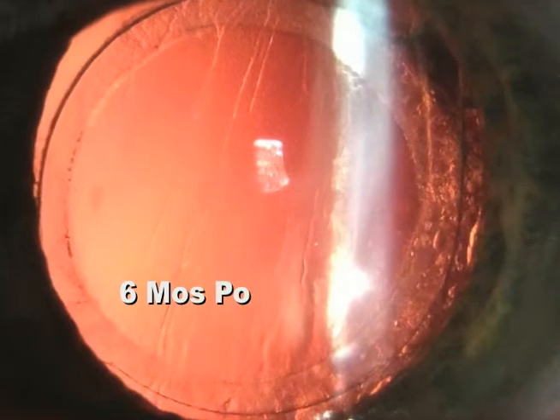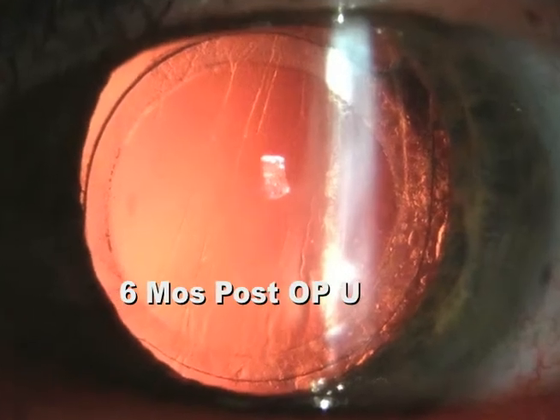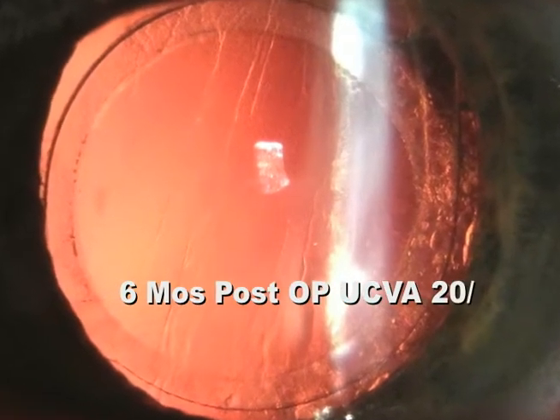Here, 6 months following surgery, we can note no phimosis of the anterior capsule, a perfectly centered single-piece acrylic lens, and vision improved to the 20/25 level.